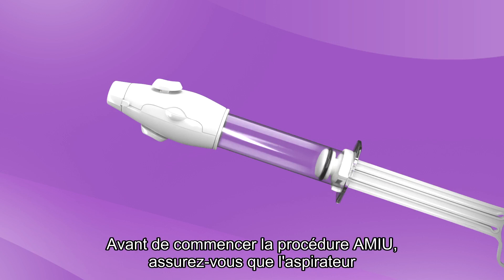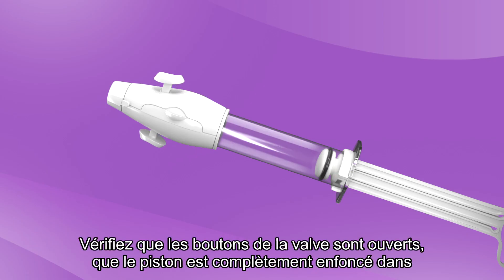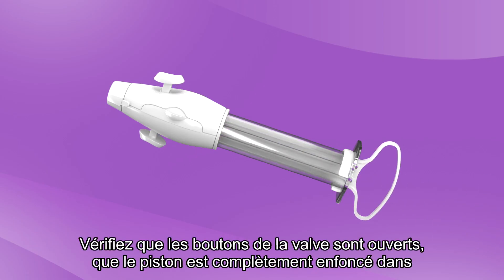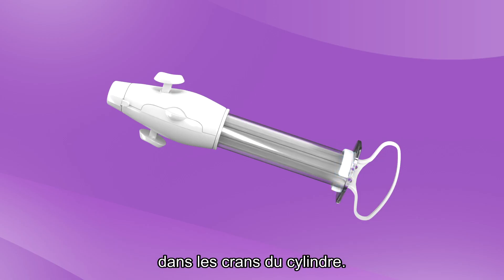ensure that you have the aspirator and its accessories clean and ready. Make sure that the valve buttons are open, the plunger inserted all the way inside the cylinder, and the collar stop locked in place, with the tabs pushed down into the holes in the cylinder.